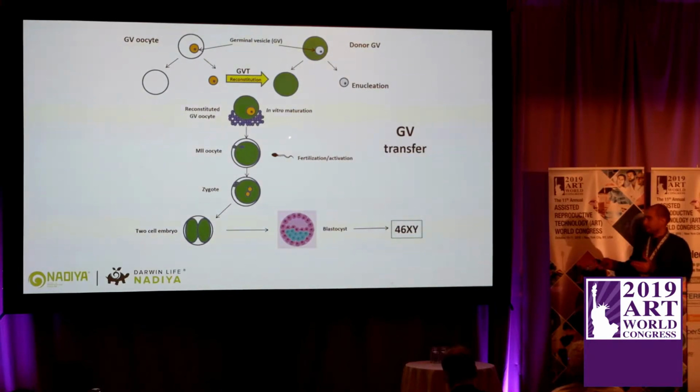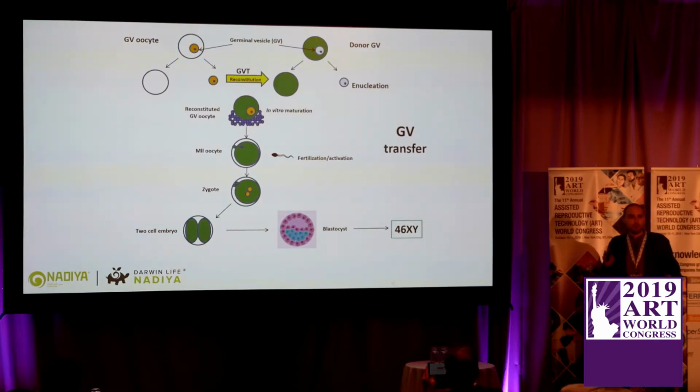cut and paste. Again. The trick here is to provide in vitro maturation for these oocytes, and I can say that even in one step, even with a very low efficiency of IVM or culture of the GV cells, we have euploid embryos. But the problem here is that this embryo we obtained from reverse reconstitution. So we used the old cytoplasm and young nucleus, and we still have the euploid embryo.